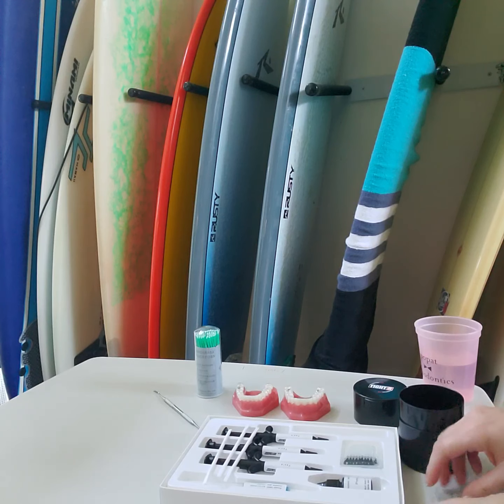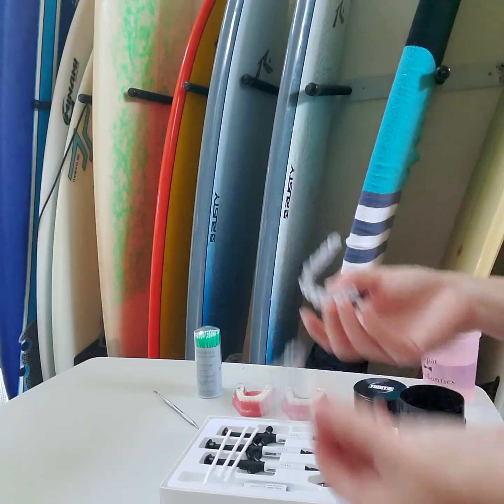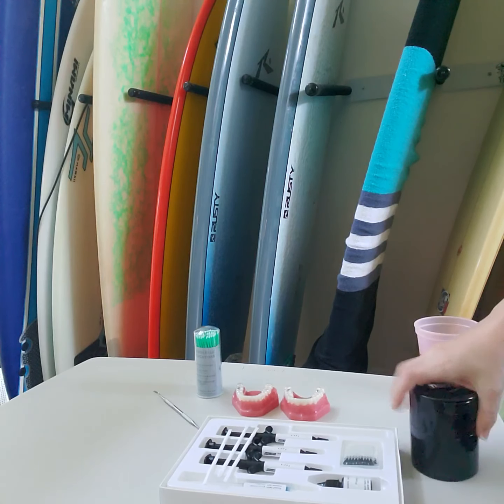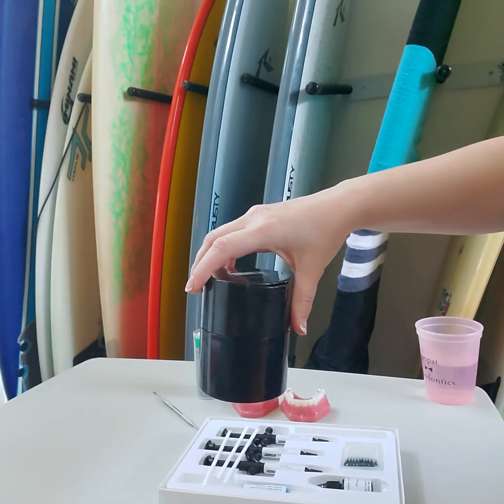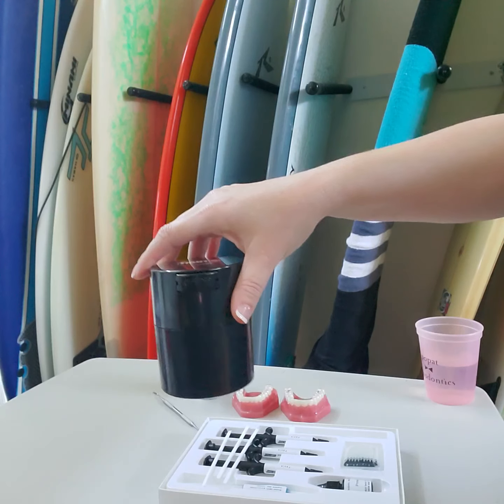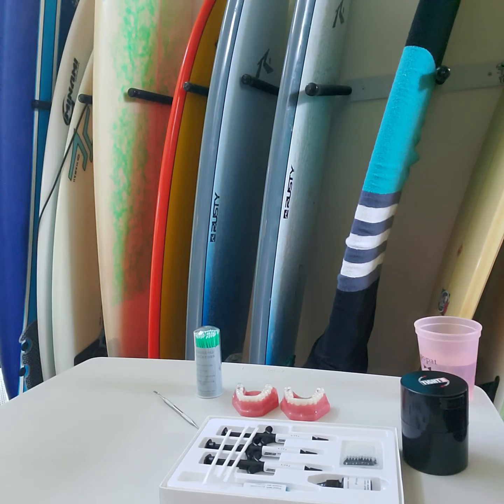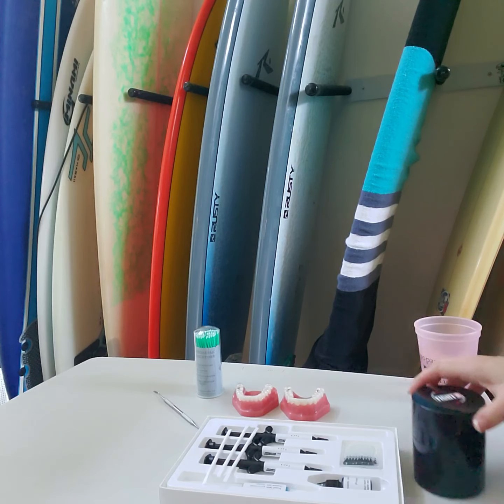So again, the tip is to fill your trays ahead of time and throw them in an airtight, vacuum-safe container. Then when you're ready to deliver, you open it up once you've etched, primed and isolated the patient, and just slap them in and light cure. It's really, really easy, okay?